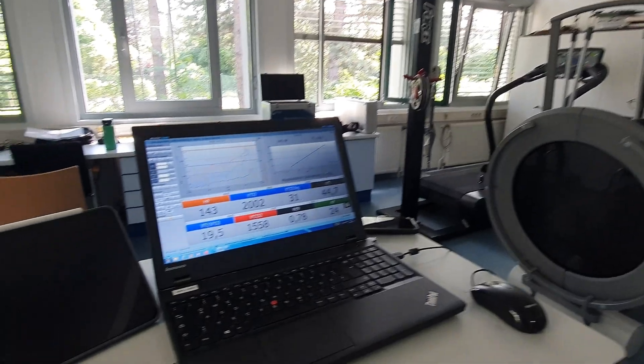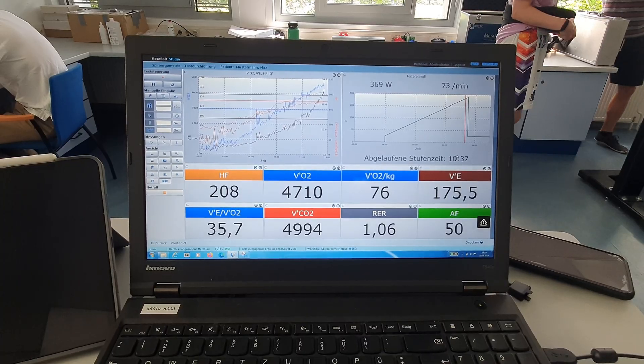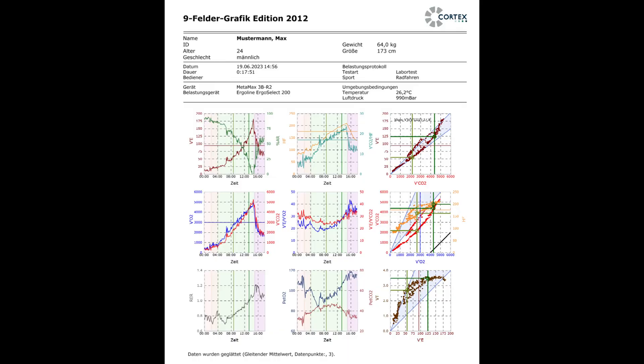Here you can see the data the subject had at the beginning and at the end of the spiroergometry. After completion or cancellation of the test, the results can be displayed as a PDF. In the PDF file, various data are displayed, including the 9-panel graph with the specific data of the test person.